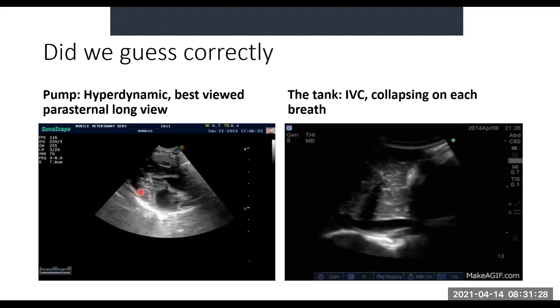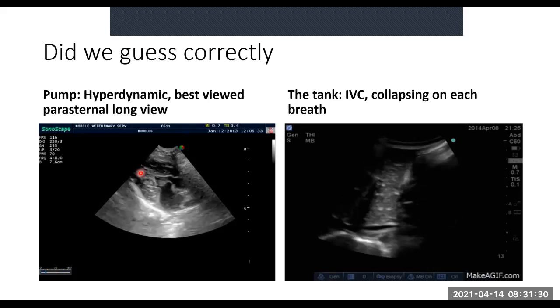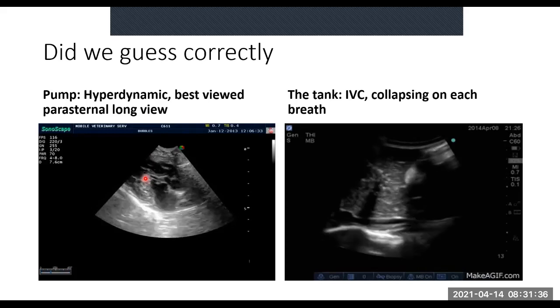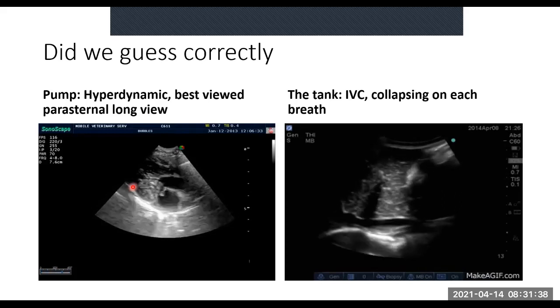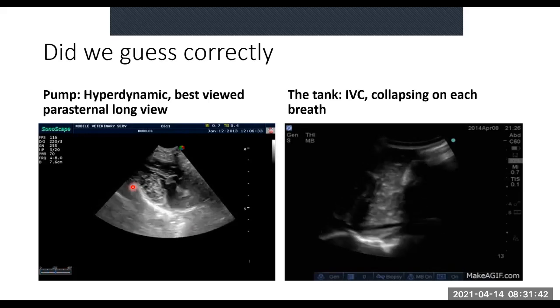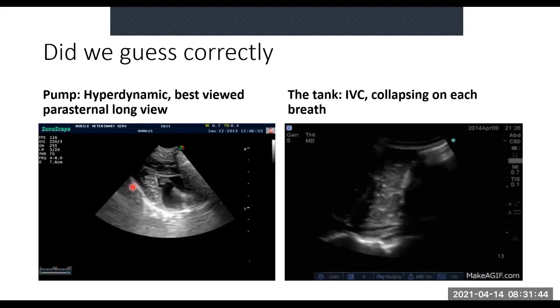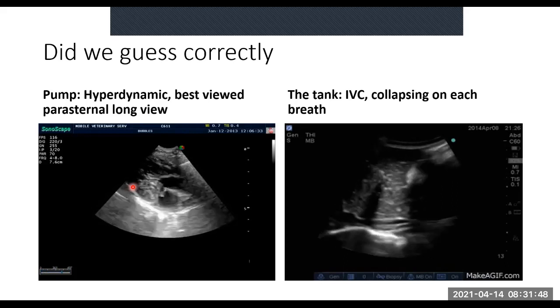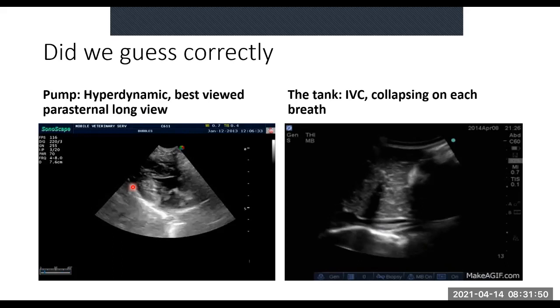It's working really hard, isn't it? It's pumping really fast. And what do you notice if you compare it to the right ventricle, where with every contraction there's still a bit of space? Can you see any space over there with each contraction? No, because it's trying to push out whatever fluid it has. It's pushing as hard as possible, trying to get out as much as possible.